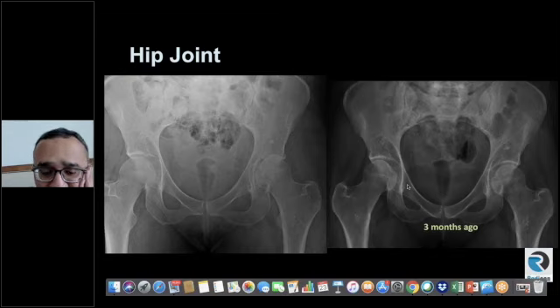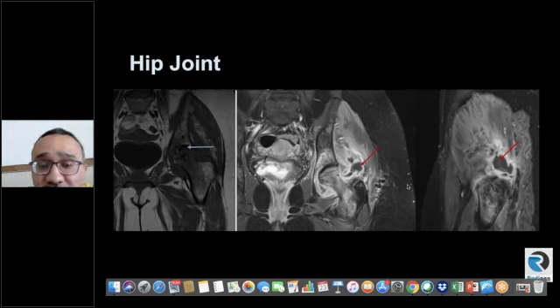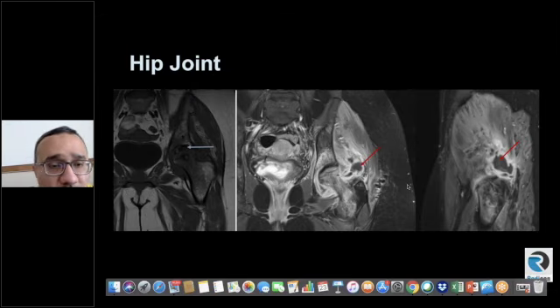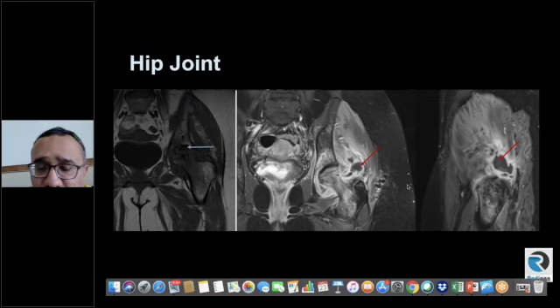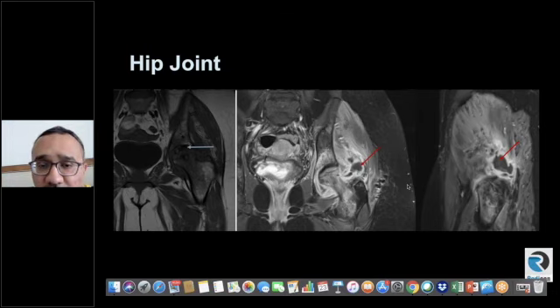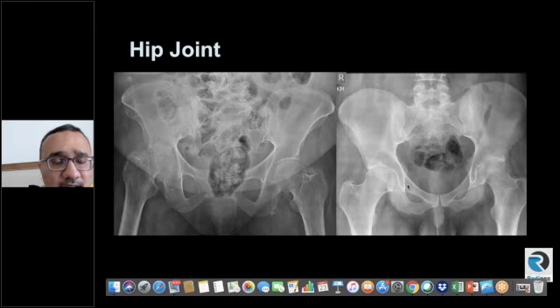When there is rapid joint space loss in a matter of a few months, you have to think about infection. In this case, this patient was a sickle cell disease patient — though that history is not directly given, there are signs of sickle cell on the film. Look at the MRI: the patient has AVN of the femoral head with enhancing effusion of the hip joint extending into the adjacent gluteus minimus muscle. This was septic arthritis of the hip joint in a sickle cell disease patient.